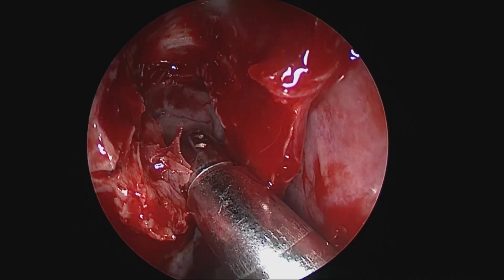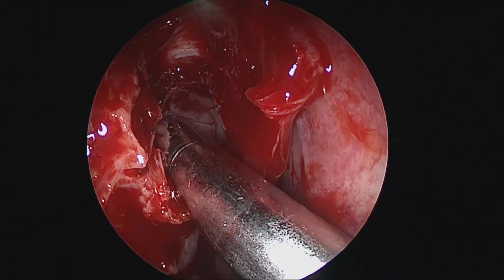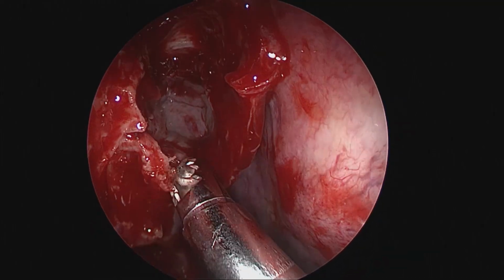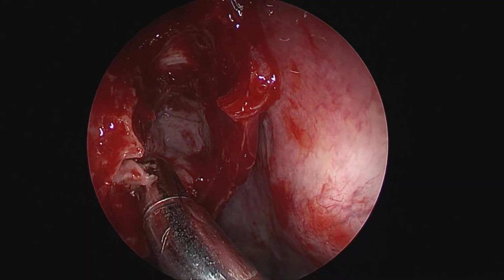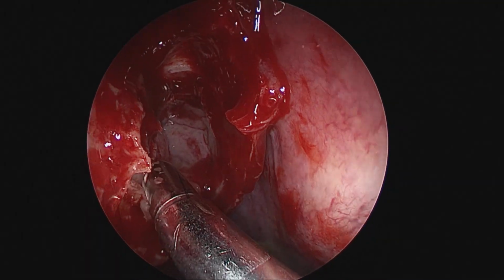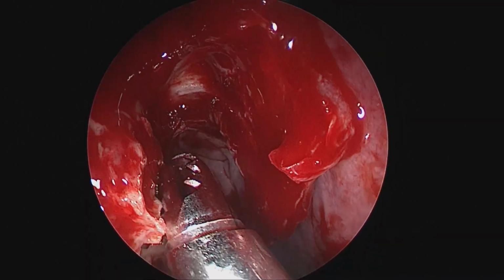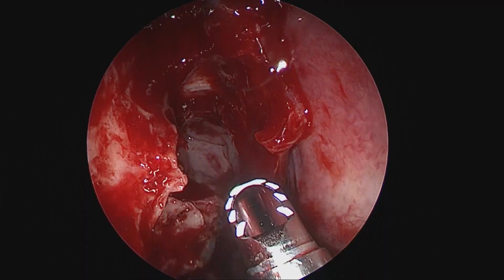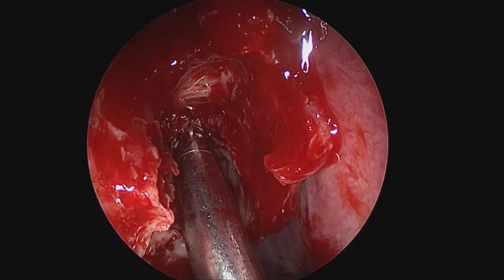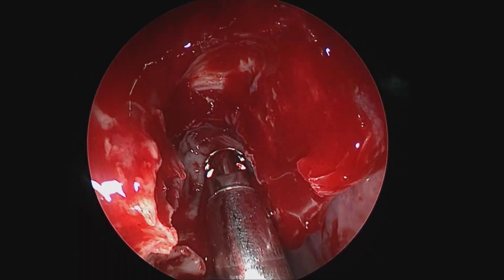You can see how the inferior part of the ethmoid cavity is almost completely clean and just has some scar and polyp tissue and no actual papilloma disease, which is limited to the superior part of the ethmoid cavity as well as the frontal recess region, which has been cleared. And now our goal would be, once all cells are open, to be able to conclusively ablate and maybe drill whatever amount of diseased periosteum or bone that we can find here.